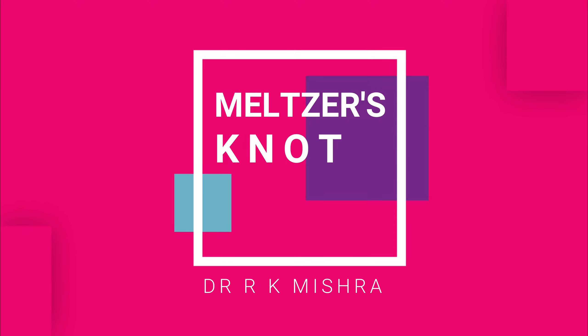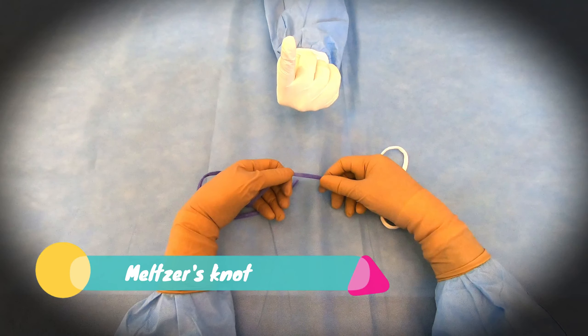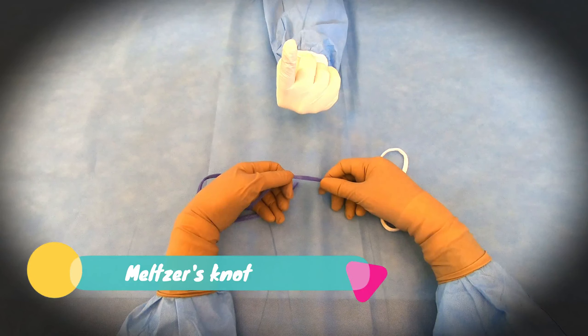Hello friends, we will see now how to tie Meltzer's knot. Meltzer's knot is also called as modified Roeder knot and it is basically designed for monofilaments.